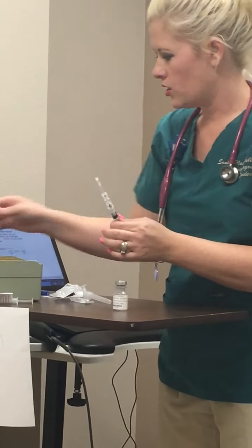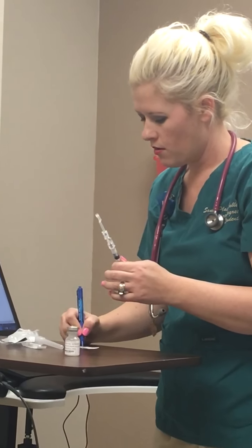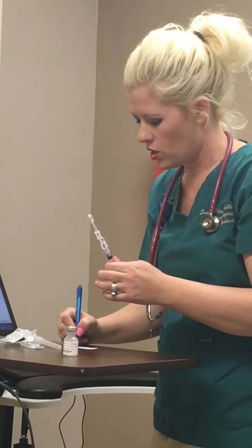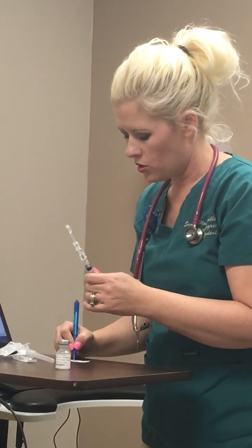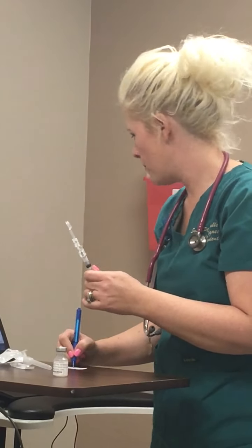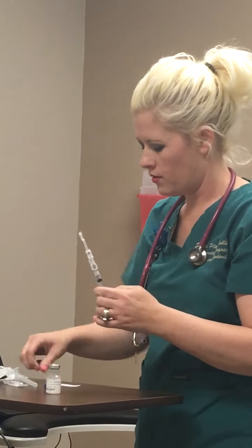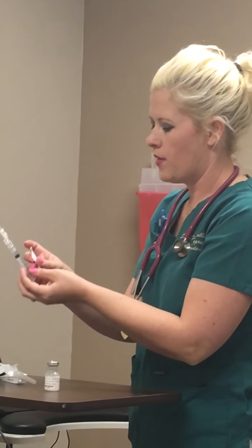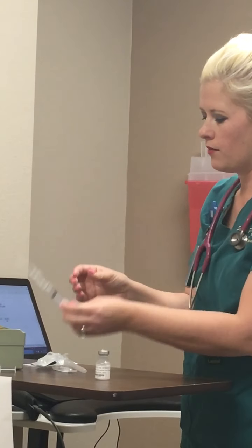Okay, before I let this go out of my hand, once again, I'm going to go ahead and label with the medication, with the dose, with my patient's initials, with the date and the time, and put my initials. Labeling at the bottom, making sure that I do not cover my medication and flagging.